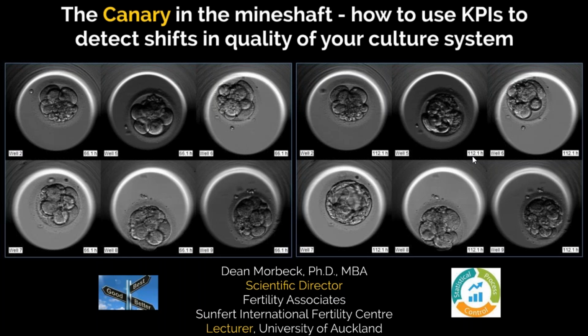Now, what I didn't show at all in this presentation was the fact that we did do a thorough statistical analysis of those 3 5-month periods, where we controlled for age, we controlled for number of embryos. You know, we controlled for as many factors as possible, and to illustrate that, yes, indeed, there was still a difference between them, because it's a good point. If you have a period of time where you have a lot more poor prognosis patients or older patients, then the shift you see may just be due to the patients.